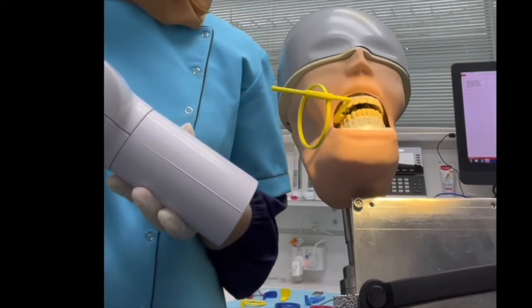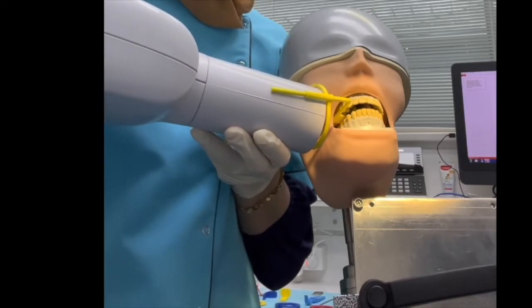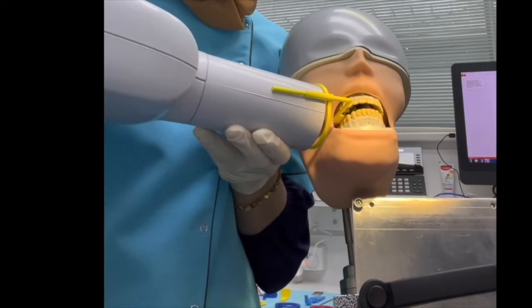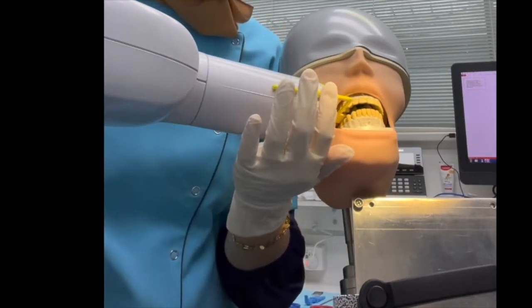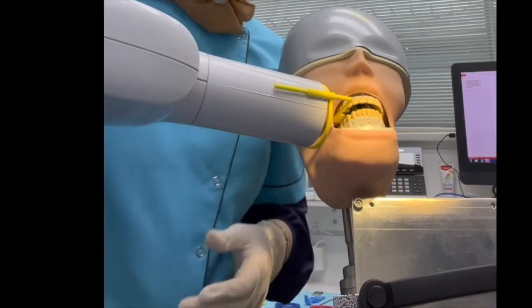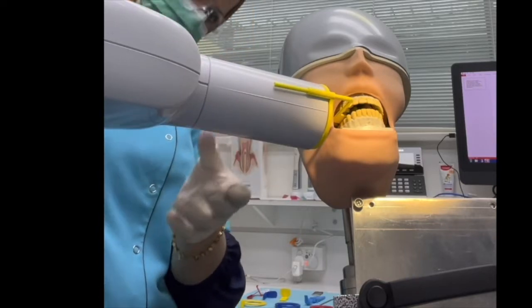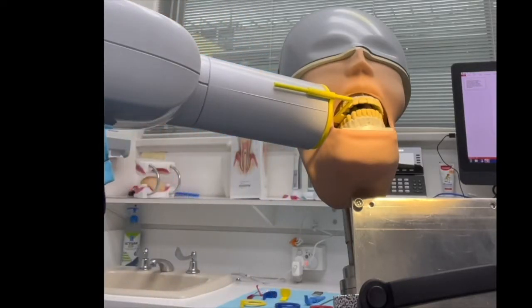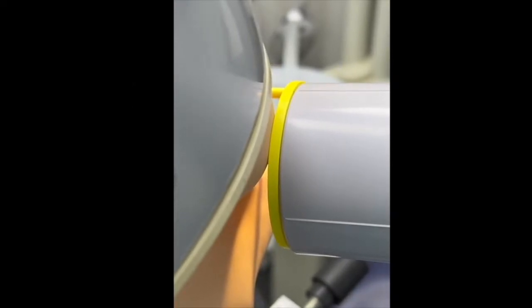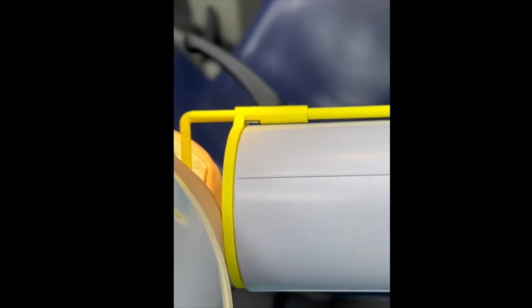Now get the cone. When you place the cone, there must be no space between the cone and the ring — it should be flush. Also, the long arm of the film holder should be parallel with the cone to avoid overlapping. See how it's flush with zero space, and those two lines are parallel to each other.